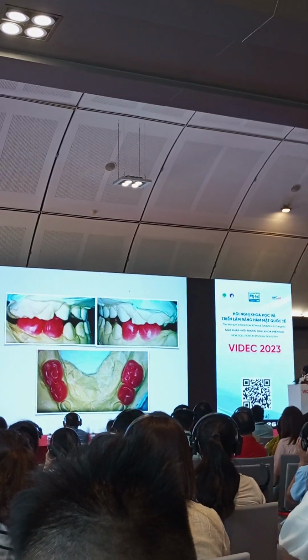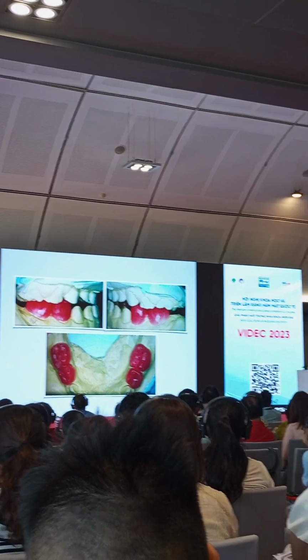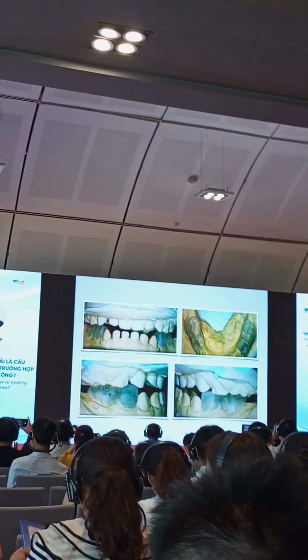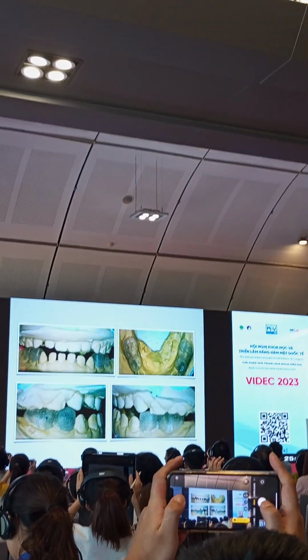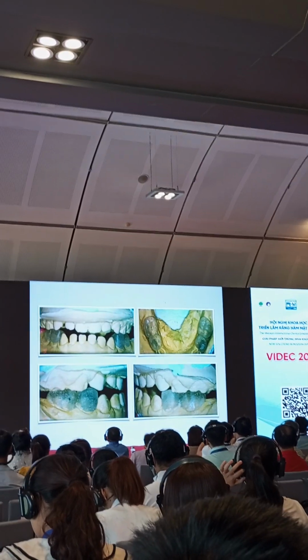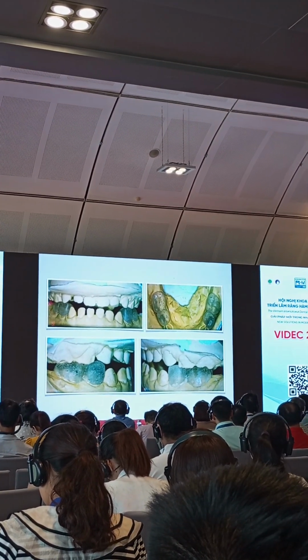After carving it, take an impression and pour self-cure acrylic, and then you now have an acrylic. Unfortunately, because I don't do any general dental work, I only have clear acrylic in my clinic. So I used the clear self-cure acrylic, and it was ready for the patient when they came back.